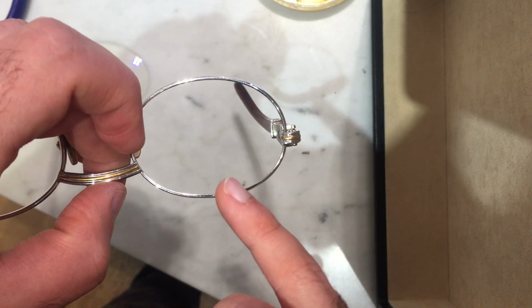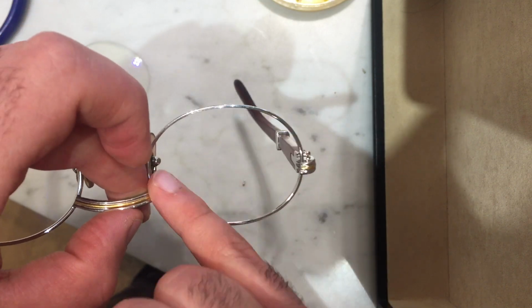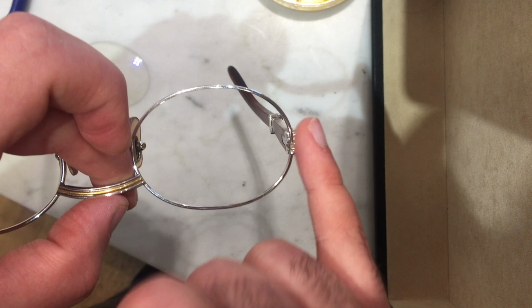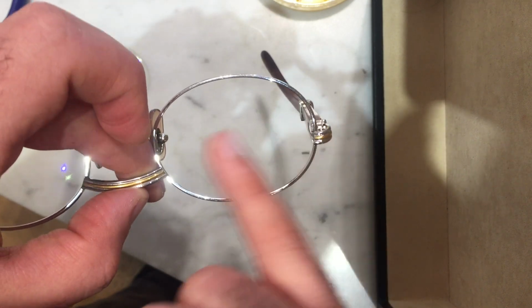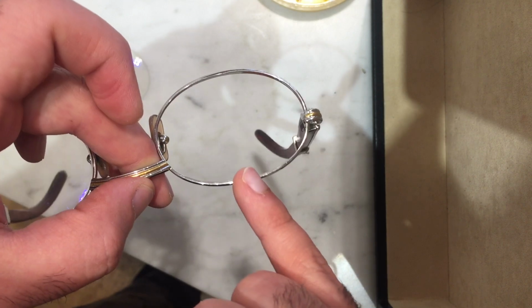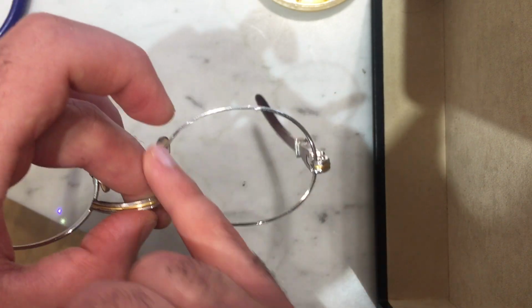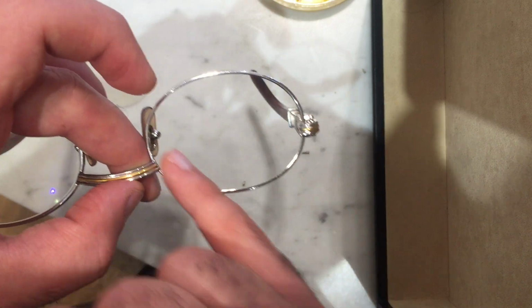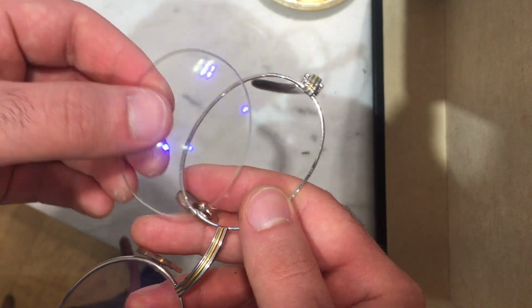The reason I said this is not recommended is that all this is doing is pushing the loose areas to the sides, and eventually it is going to pop out again, but it's way harder to pop it out of the sides than it is to pop it out the front. I'm not sure exactly why. It might have to do with the surface area that's touching the lens. It's a little bit less here than it is on the top. So that's the one thing you can do.